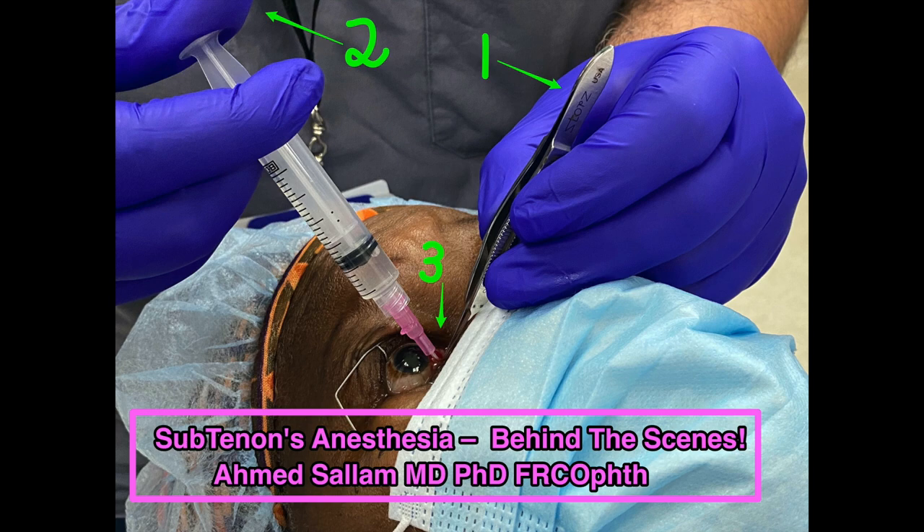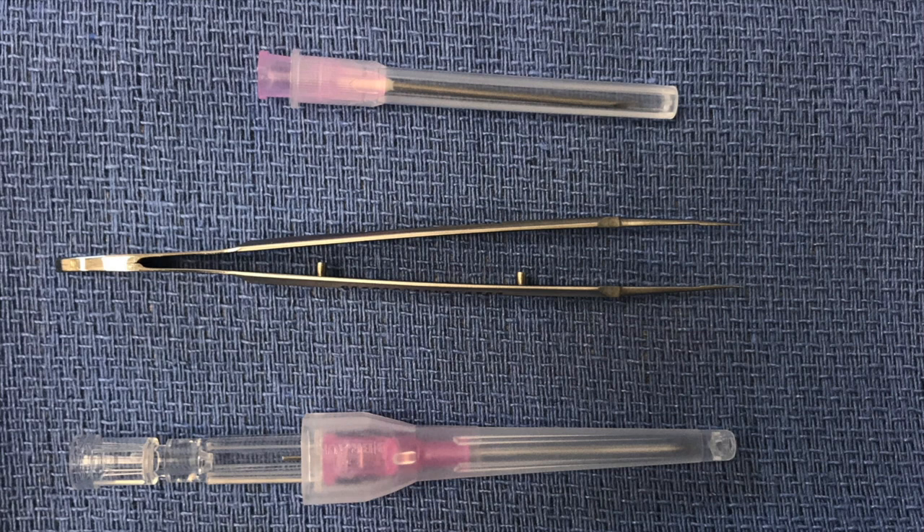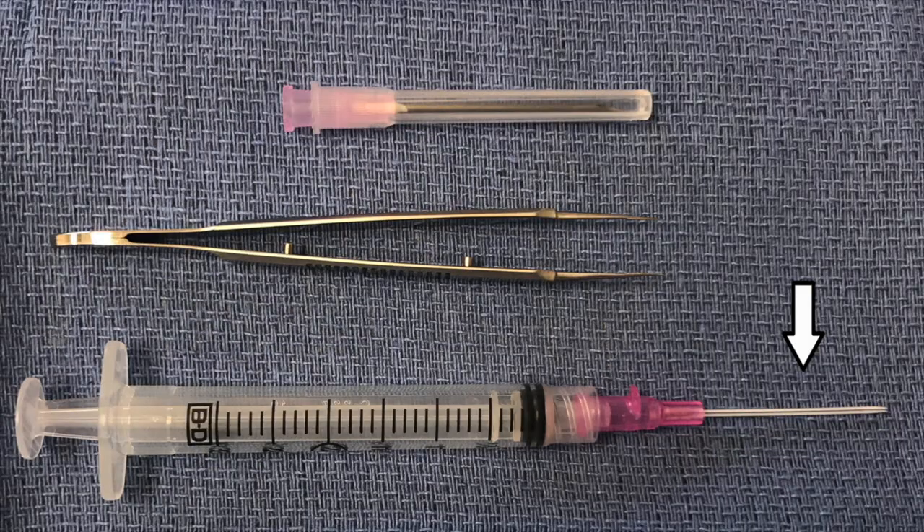Hi, this video is about what happens behind the scenes during sub-Tenon's anesthesia. These are the instruments we're going to use: an 18-gauge needle, conjunctival forceps .12, and a 20-gauge angiocath.